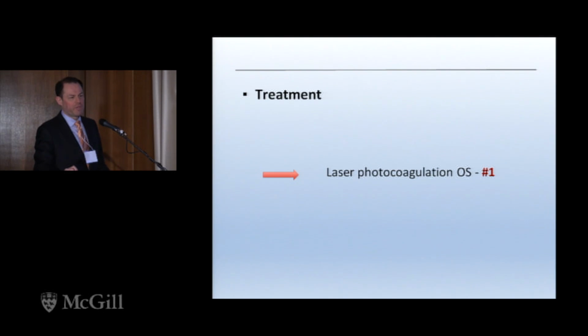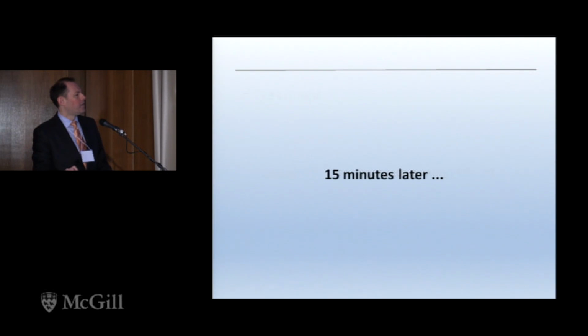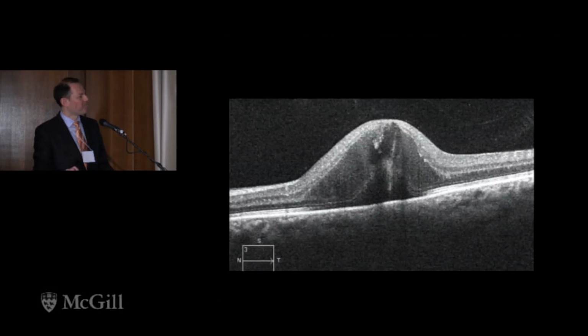So this patient was treated with laser based on the fact that they were starting to have their central vision affected. Plus the other eye was amblyopic, so you don't want to wait too long in these patients to potentially compromise their better seeing eye. And 15 minutes after the treatment was done, the patient said, "C'est flou," meaning my vision is blurry in this eye. Never a good thing to hear.